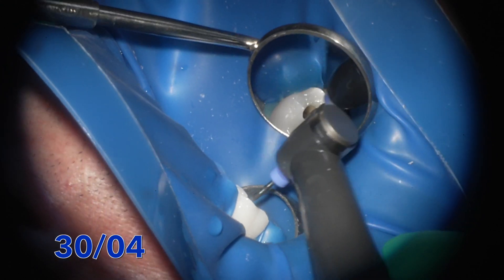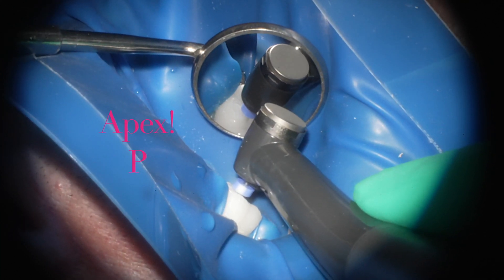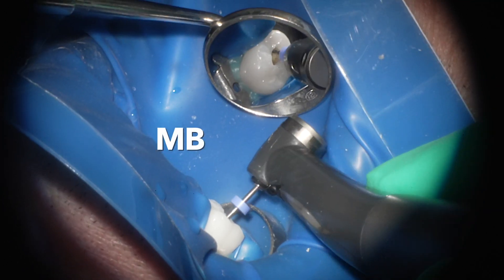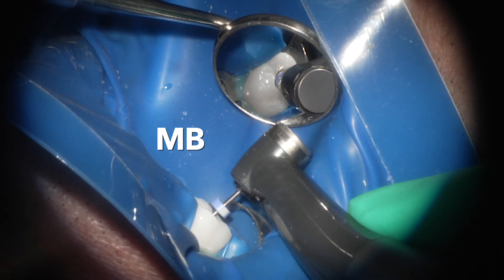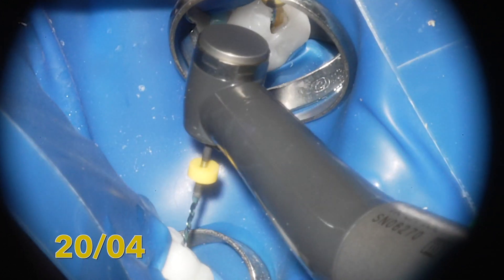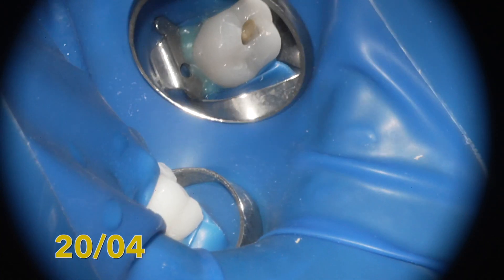I'm taking the 30 04 down to the apex on the palatal. On the distobuccal, after two rhythm motions the 30 04 is not down to the apex — it's a pretty tight canal on both the mesiobuccal and distobuccal. The tip of the file is getting engaged quite a bit each time. After each instrumentation: ultrasonics, vacuum, then add Triton. Now using the 20 04, which moves very nicely, and after a couple of motions we reach the apex on the distobuccal on the second pass.